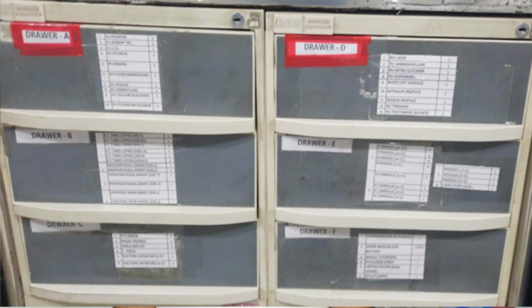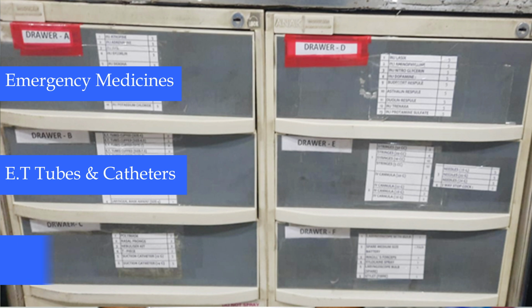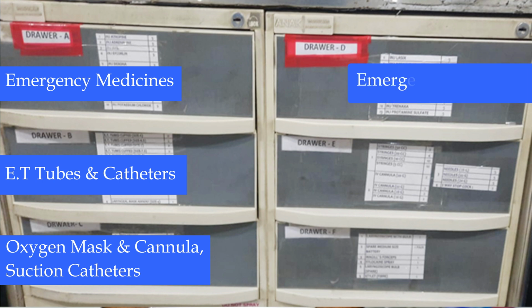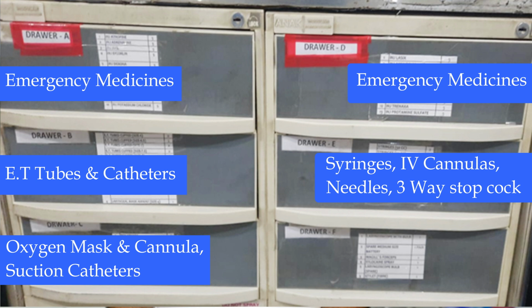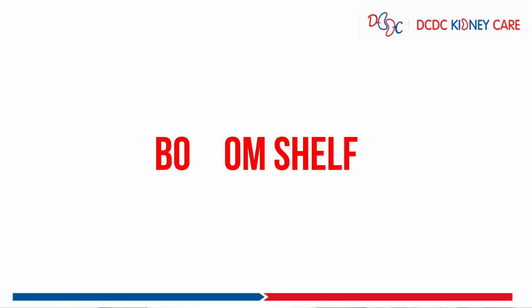Drawers. We have 6 drawers, in which drawer A is for emergency medicines, drawer B for ET tubes and catheters, drawer C for oxygen mask, cannula and suction catheters, drawer D for emergency medicines, drawer E for syringes, IV cannulas, needles, 3-way stopcock, and drawer F for intubation equipment.